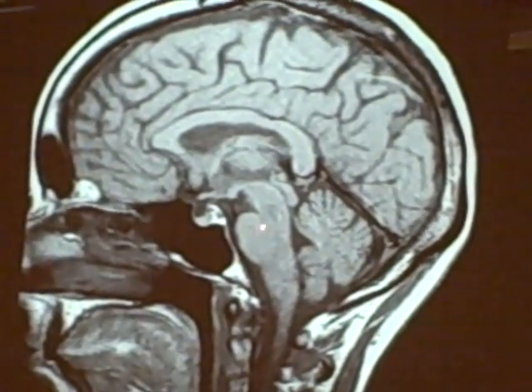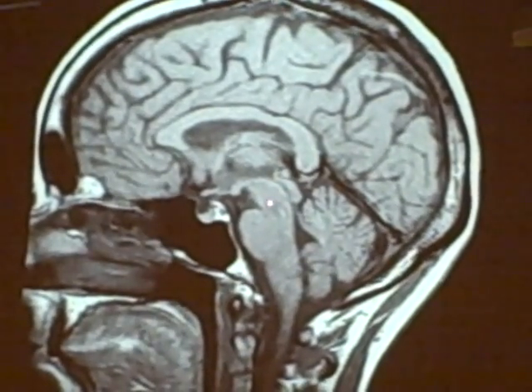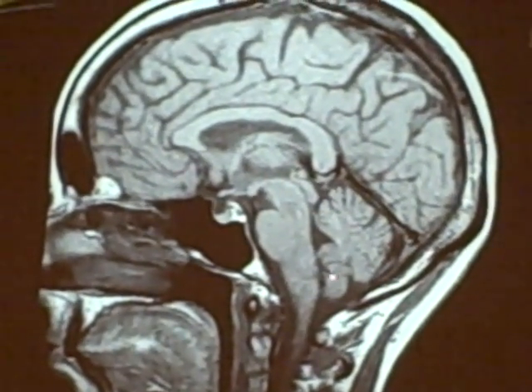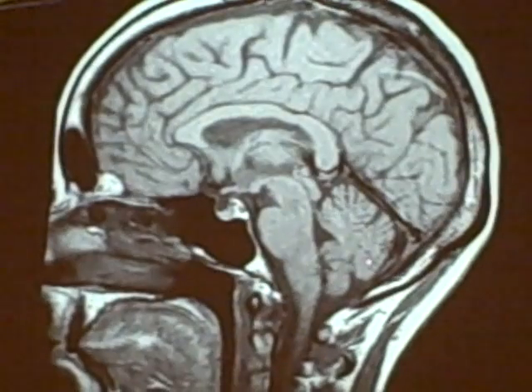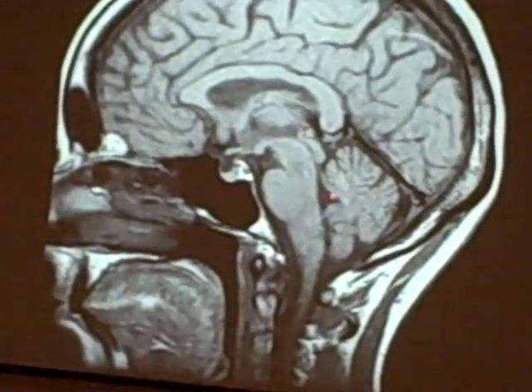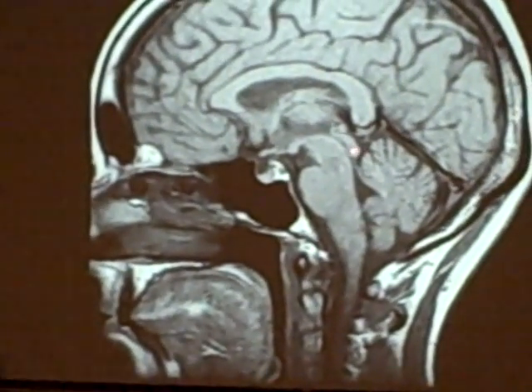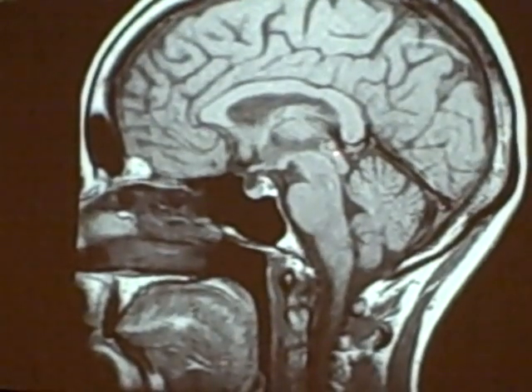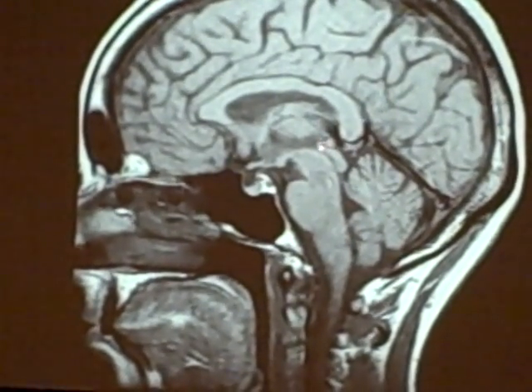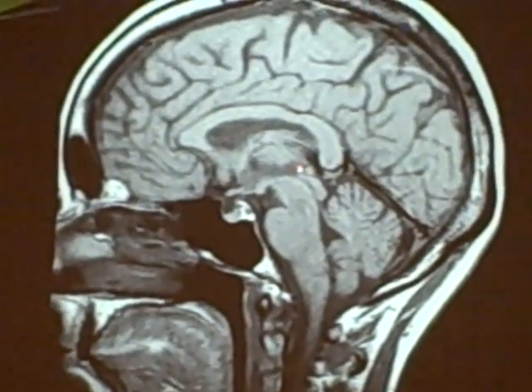Medulla, pons, the tegmentum of the midbrain, the cerebellum back here, the fourth ventricle, and here we see the inferior colliculus, the superior colliculus, and the posterior commissure right above.